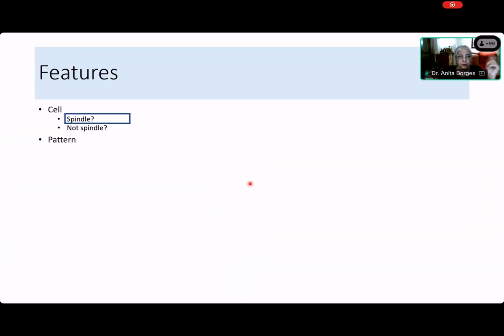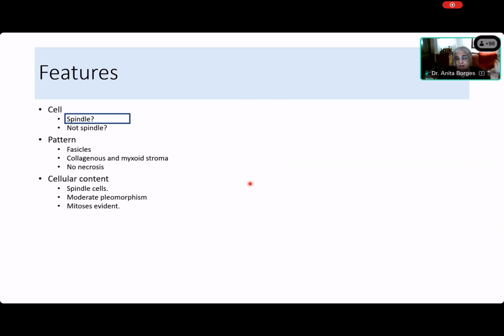So what is it? Of course, it's spindle. It's got fascicles, it's collagenous and myxoid. There is no necrosis. And the cellular content, yes, it's spindle cells, moderate pleomorphism, and there are mitoses in this. Okay, there is no necrosis, but there are mitoses. So what do we do next? We think of possibilities. We know that it is a malignant spindle cell tumor, but it is also pleomorphic. So what is the history?